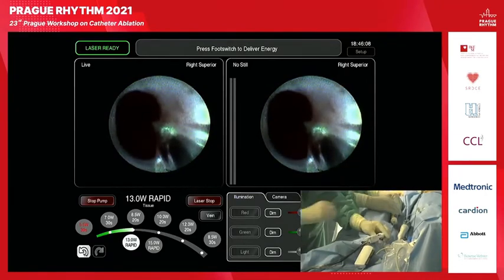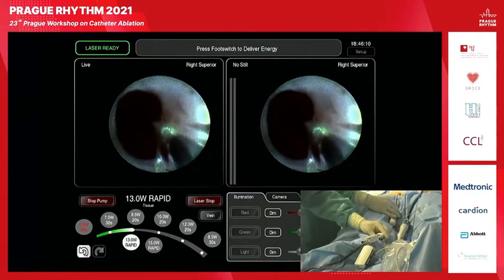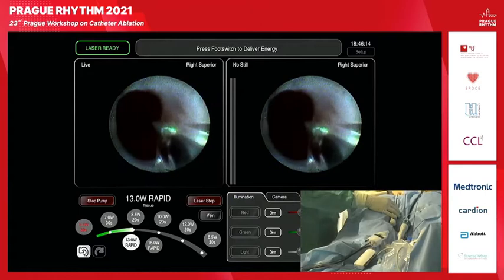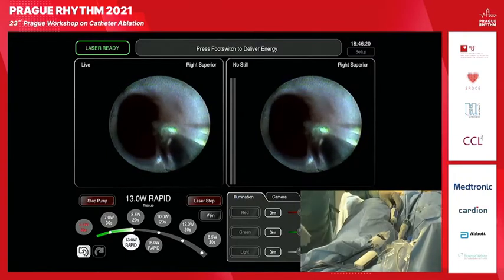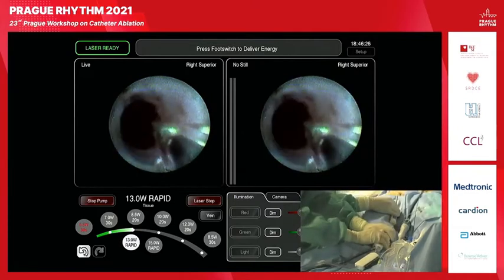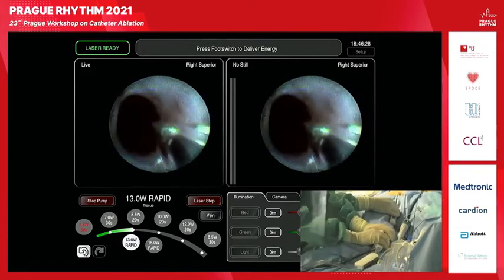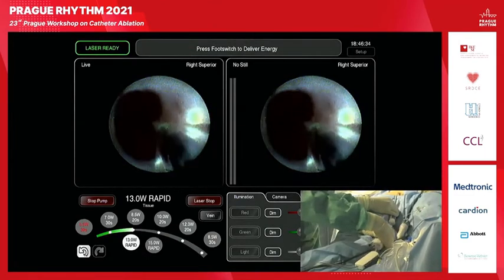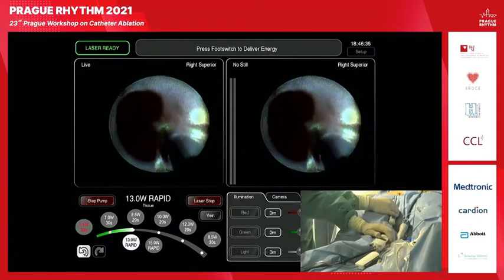So, guys, I will start with 13 watts. What is important, we are on the right superior vein, so we need to get phrenic nerve pacing. Can we go for capture? Pacing, capture. Okay, so it's capturing. So we'll go through all the vein with phrenic nerve pacing.